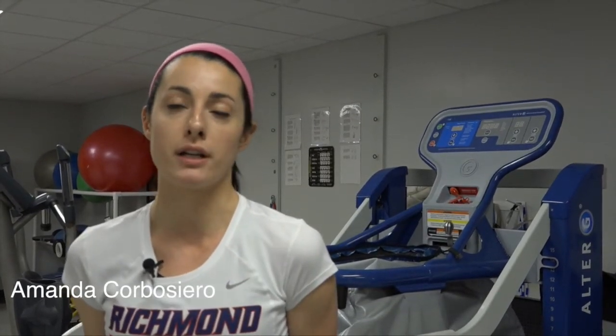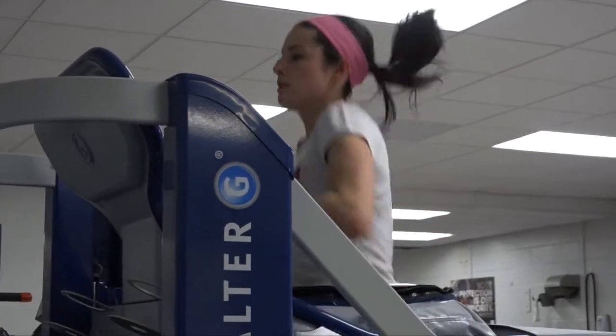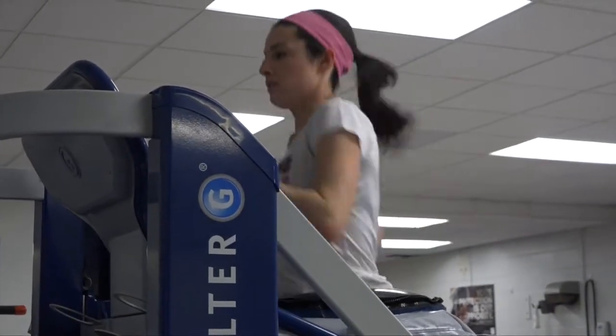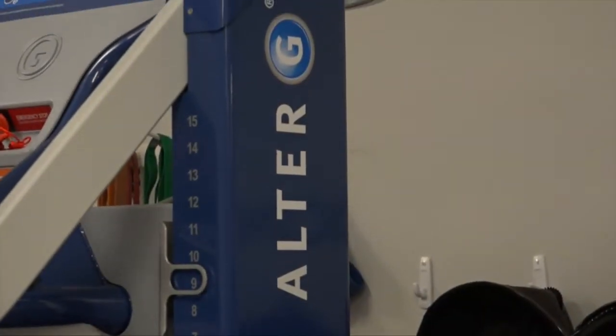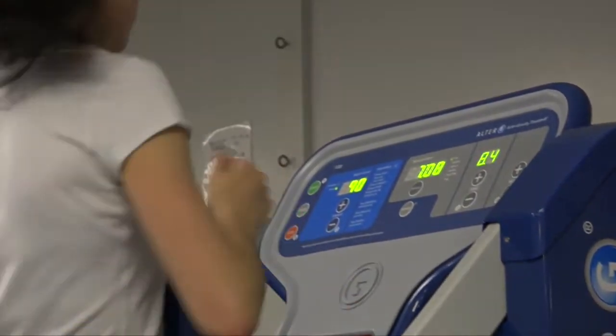During my cross-country season, I had a stress fracture in my foot, so I was pretty much out from running for quite some time. Having the Alter-G was really nice because I was able to still get in the training that I normally would do outside, but without having any pressure on my body. It definitely helped me get back sooner, and once I was fully running, having the Alter-G gave me the substantial training I would have missed from being injured.